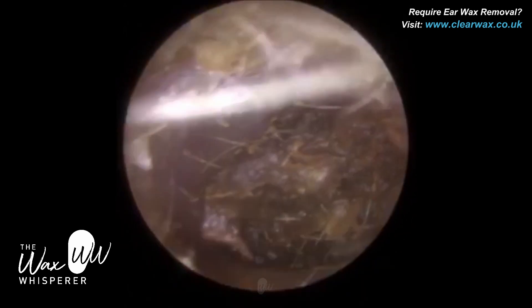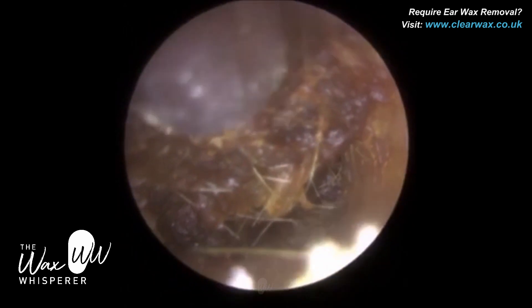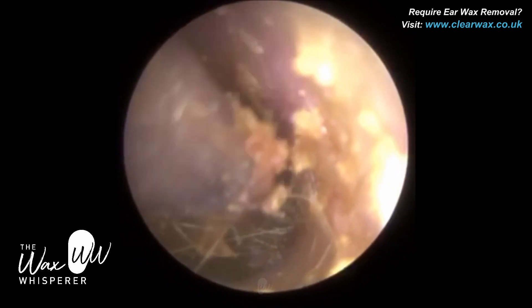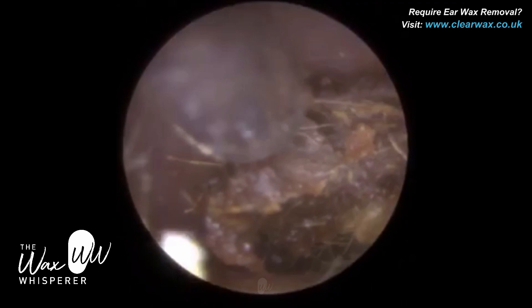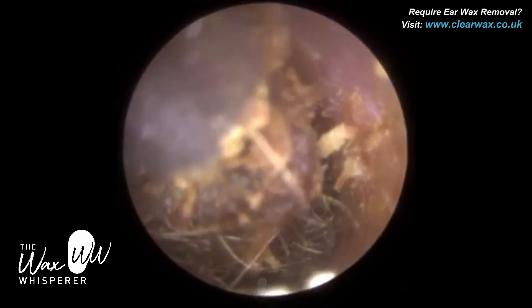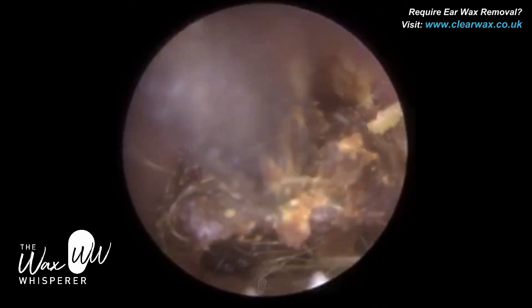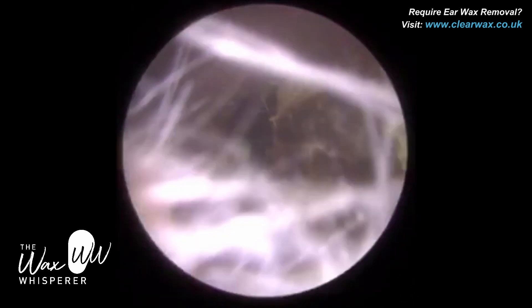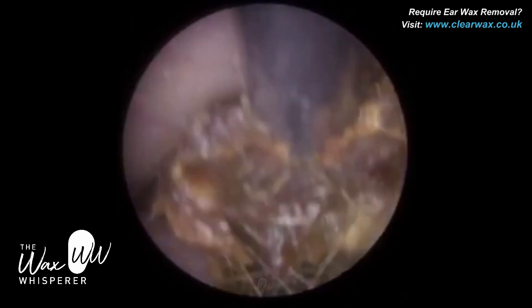There is a remaining plug of wax which is quite medial — it's up against the eardrum actually — and again I'm just loosening this from the posterior canal walls, the back part of the ear canal. You can see there's a few hairs there as well, so there is a bit of matted ear wax which is always a bit more difficult to remove. Nonetheless, there we go — that's the second plug.